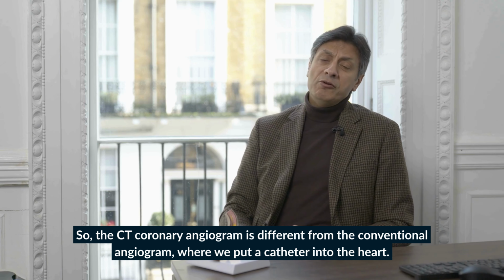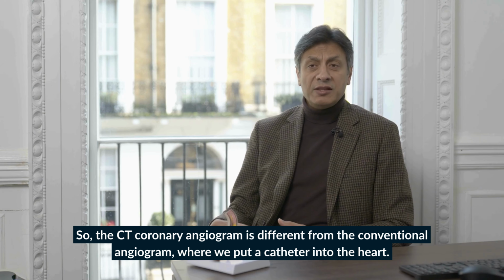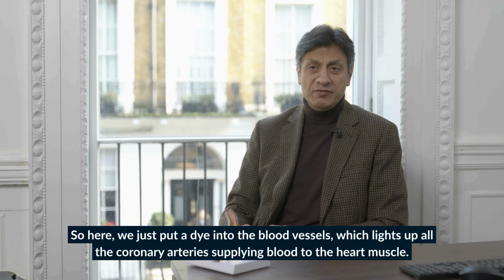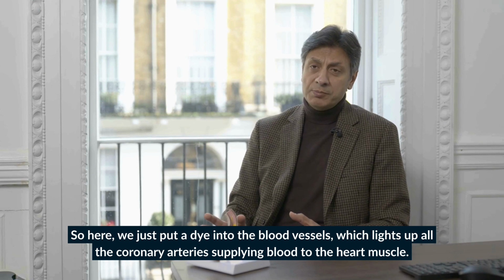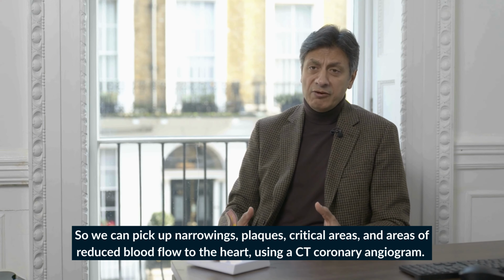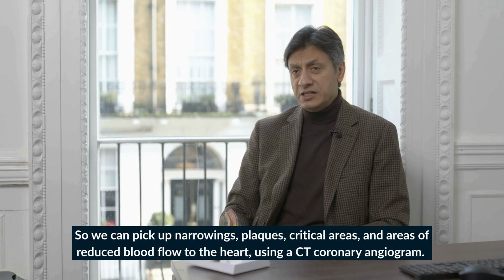So CT coronary angiogram is different from the conventional angiogram where we put a catheter into the heart. So here we just put a dye into the blood vessels, which lights up all the coronary arteries supplying the blood to the heart muscle. So we can pick up narrowings, plaques, critical areas of reduced blood flow to the heart using a CT coronary angiogram.